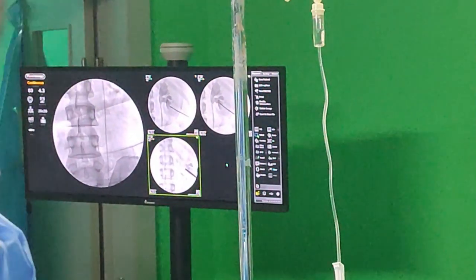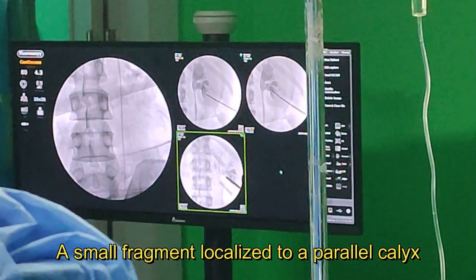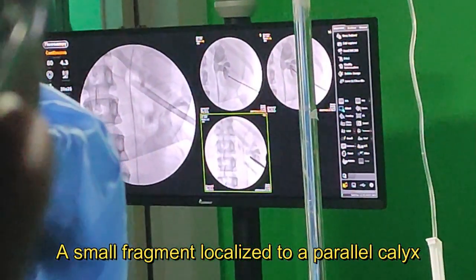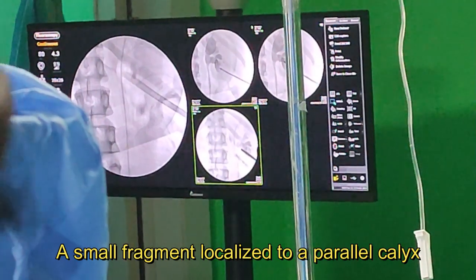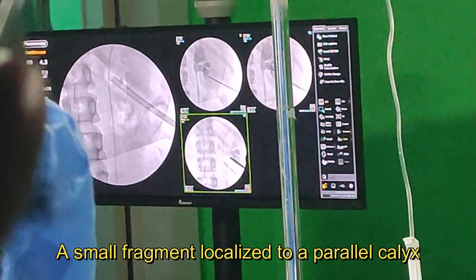I'm pressing. Yeah, pressing here to that. So let's see the up. Up. Stone. Move up. Okay. That's okay. Okay, screen. Okay, so this is good.